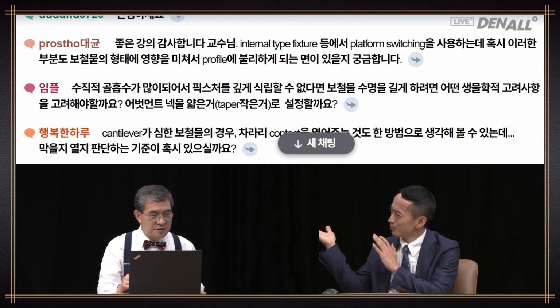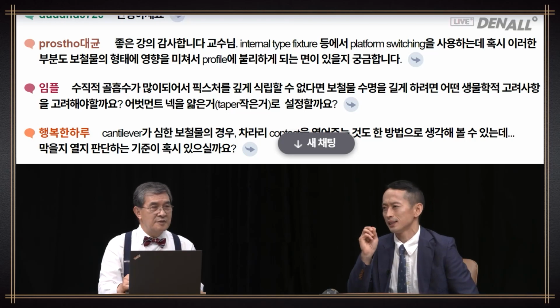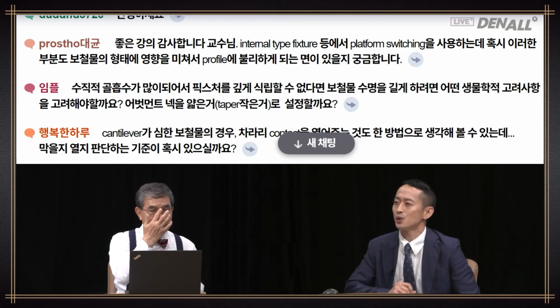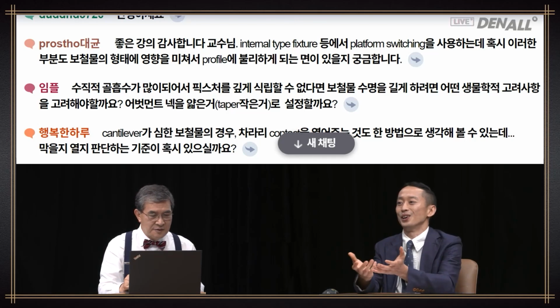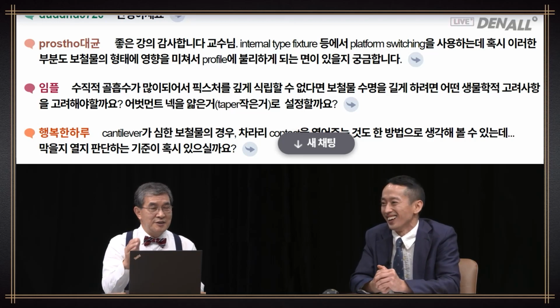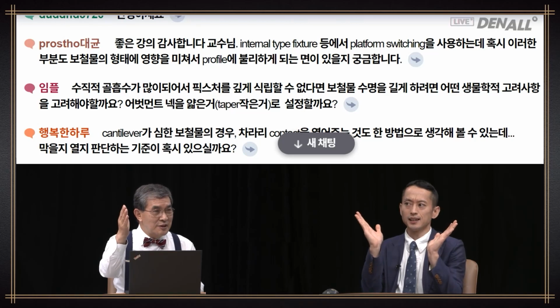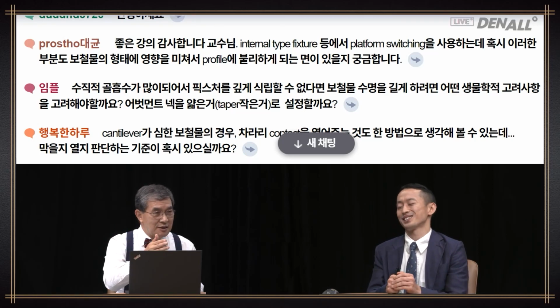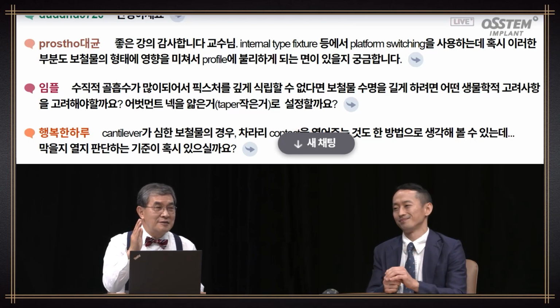As you have mentioned, in terms of emergence profile, it can be disadvantageous, but clinically speaking, there are more advantages. So advantages outweigh disadvantages. Morphologically, it can be disadvantageous, but biologically, thinking of gingival condition, there are advantages. So it's difficult to say which is bad. There are pros and cons to this.